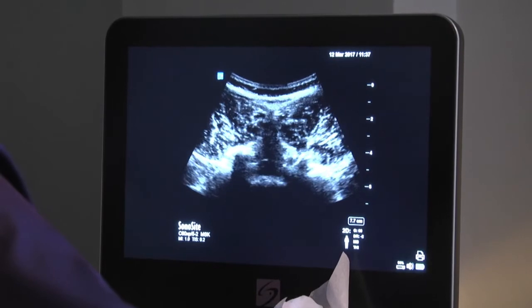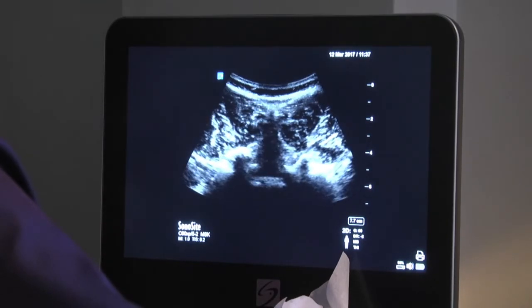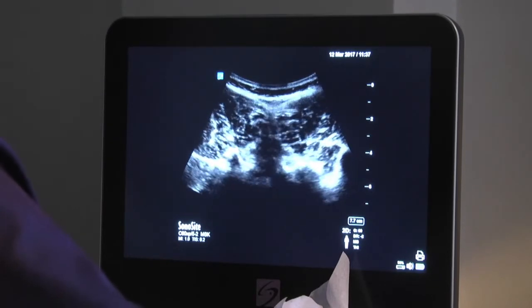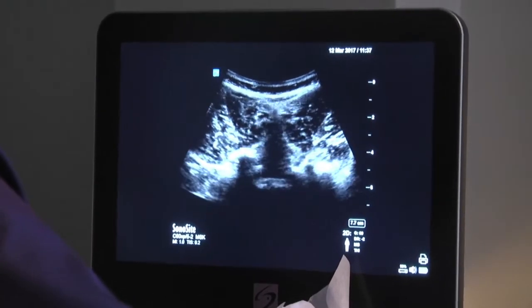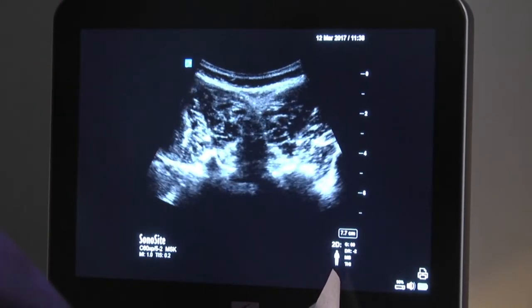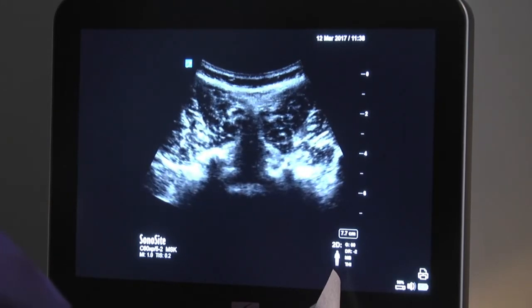Okay, you can see now the spinal, that's the posterior dura there. You can see a wide anterior complex with the lateral elements are the articular processes. They're very symmetrical. So this should be a good space to perform a spinal in him if I were to do it, because you can not only see the dura, but you can see all other structures, okay? You don't have to measure it all the time. Now you look at the scale on the right hand side of the screen. Yeah, it's about between 4 and 4.5 centimeters, okay? 4.25, something like that would be a good guesstimate as to where it is.